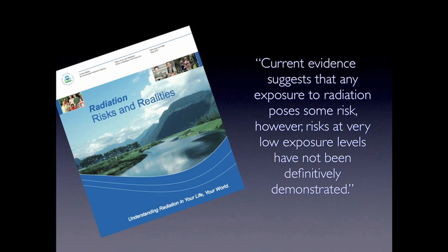And this, of course, most people know the EPA, the Environmental Protection Agency. And this quote comes from their publication on this, which says, "Current evidence suggests that any exposure to radiation poses some risk. However, risks at low exposure levels, which is what we do in dentistry and orthodontics, have not definitively been demonstrated to cause risk."